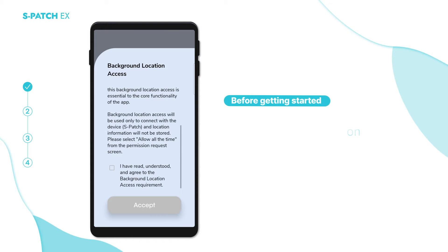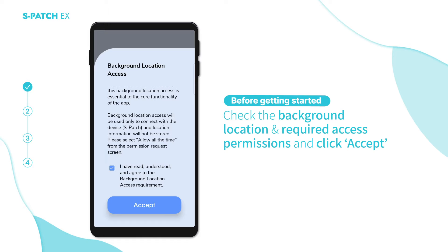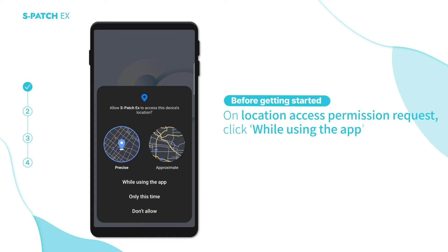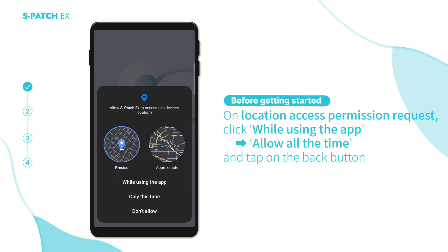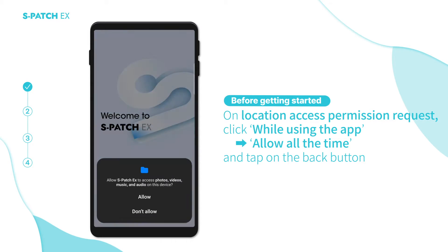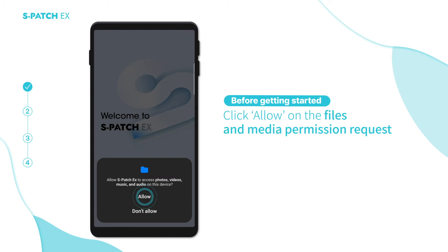Before getting started, check the background location and required access permissions. Click Accept on the location access permission request. While using the app, click Allow All the Time, then tap the back button. Click Allow on the files and media permission.